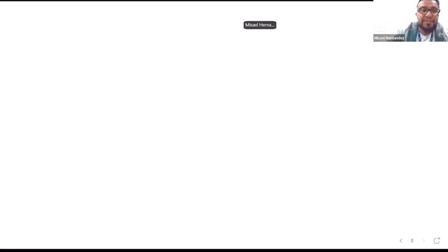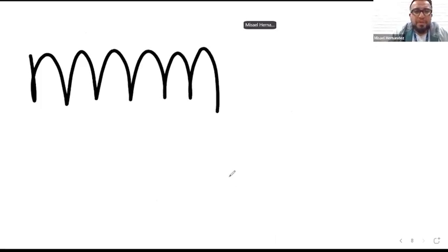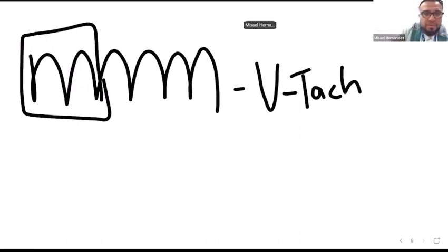But what do we see with this? For this one, remember, we're looking for PQRST. Do we see a definitive P wave? No. Do we see a QRS? Not how we're accustomed to seeing them. Do we see a T wave? No. So what's the only part of the heart that is strong enough, when abnormal, to hide all other rhythms? The ventricles. This, by the way, happens when you eat too much McDonald's. And this is ventricular tachycardia. This is VTAC.